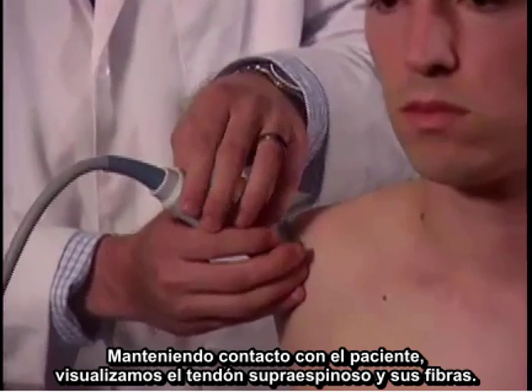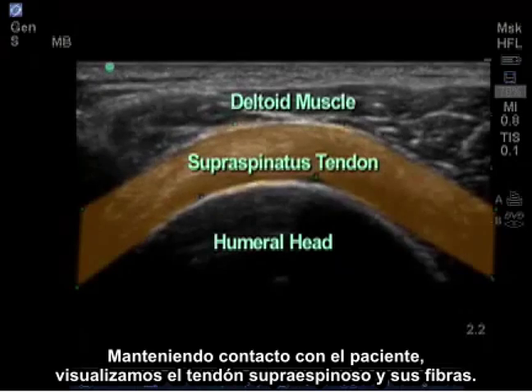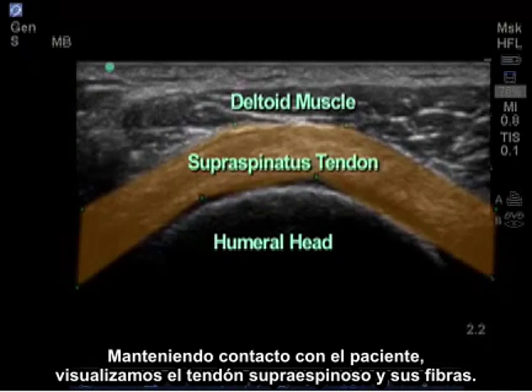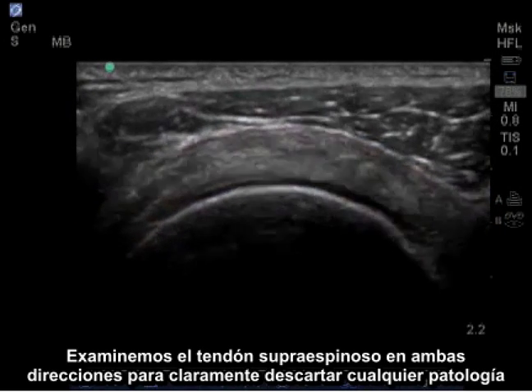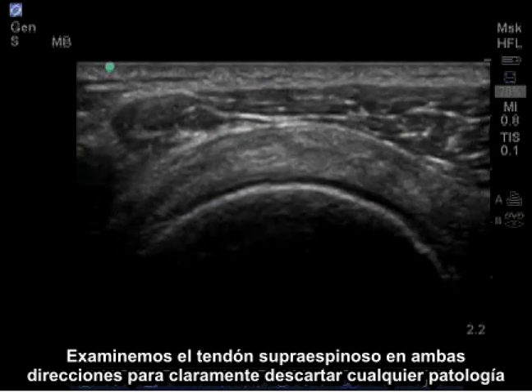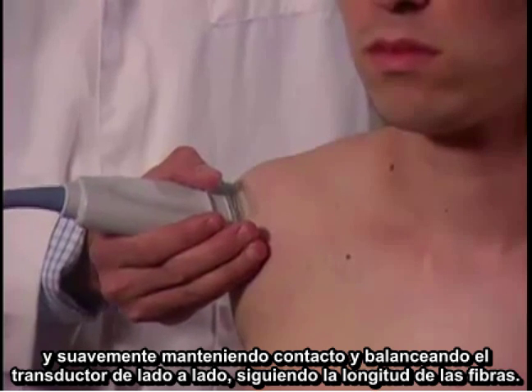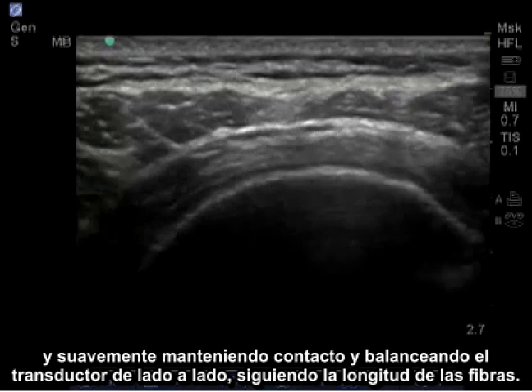Maintaining contact on the patient, I visualize the supraspinatus tendon and its fibers, and I'm going to examine the supraspinatus tendon in both directions to clearly rule out any pathology. I'm gently maintaining contact and rocking the probe side to side, following the length of the fibers.